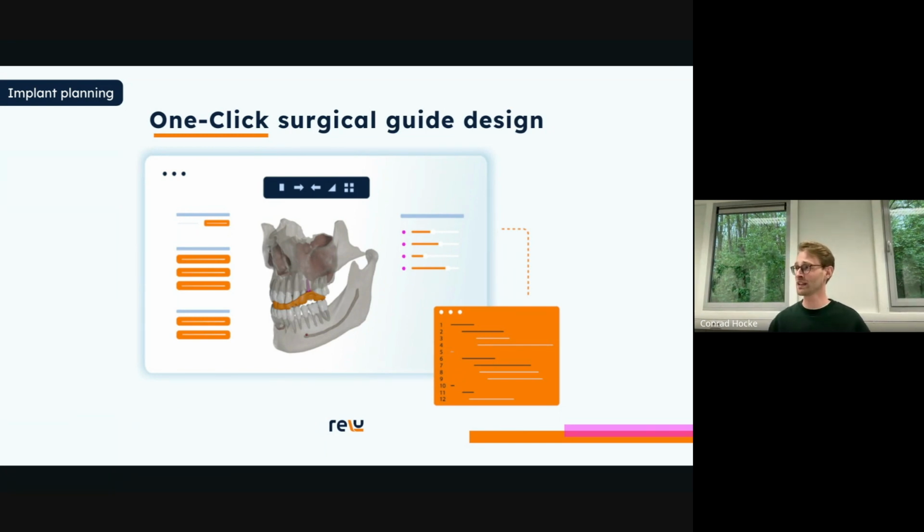And with our one-click surgical guides, we want to tackle these problems from both sides. We can significantly reduce the planning time required for an implant treatment and in turn bring down the cost, while at the same time, we offer an added layer of safety for the dentist through high quality and easy to produce surgical guides.